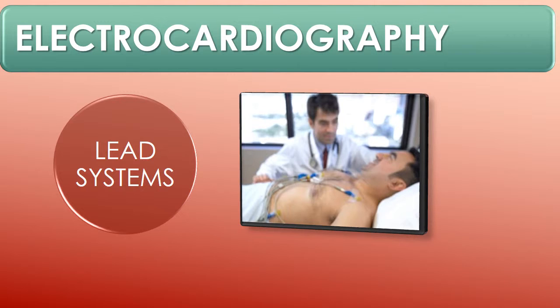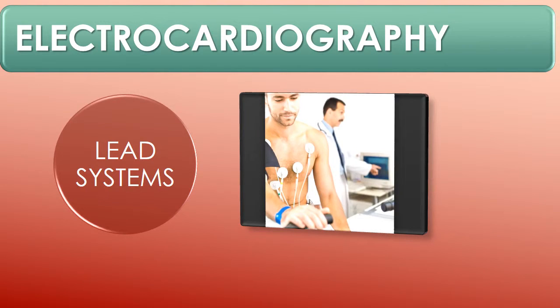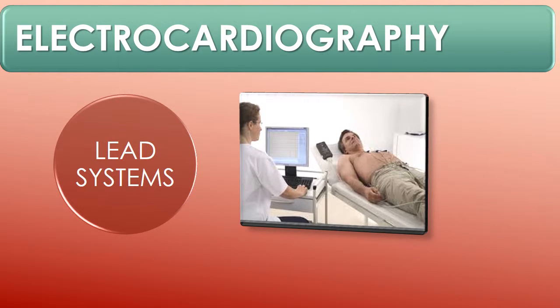When we talk about lead systems, we include the standard 12-lead ECG system. That just means that we're looking at 12 different views of the heart. Remember, a lead represents one view of the heart. You can also have an 18-lead ECG, and there's even a newer ECG on the market that is an 80-lead ECG system.